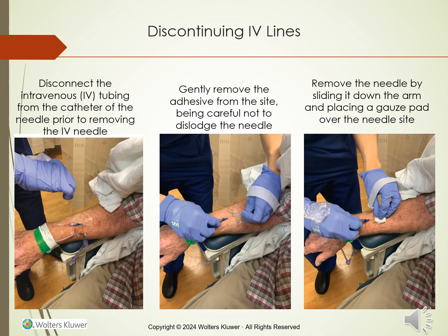An infusion should not be stopped without a physician's order, except in the event of an emergency. Patients prefer not to have their IV restarted due to discomfort. The radiographer must ensure that the IV infusion is intended to be discontinued if they need to remove the IV line, and that the catheter is removed at the end of the procedure.